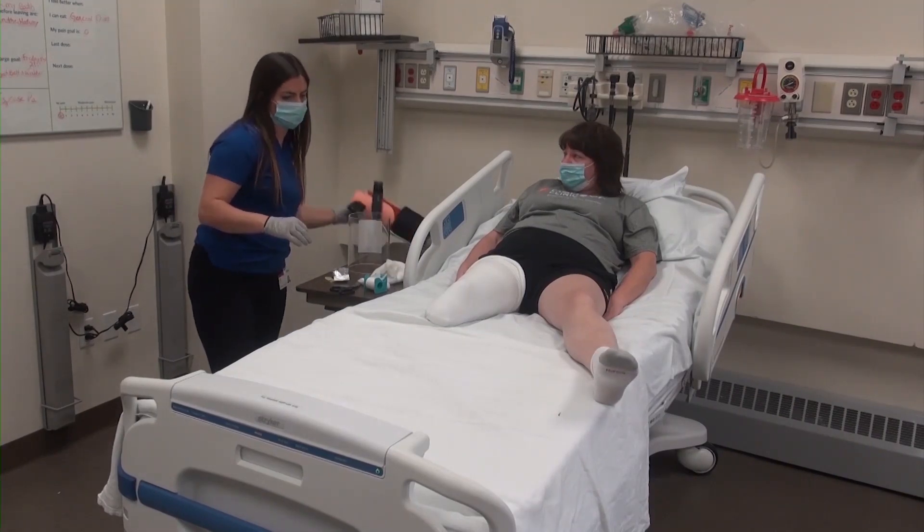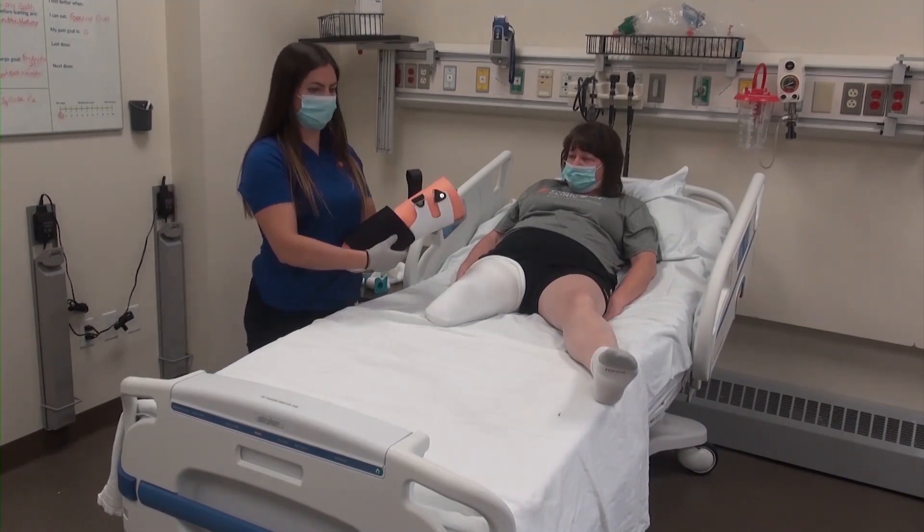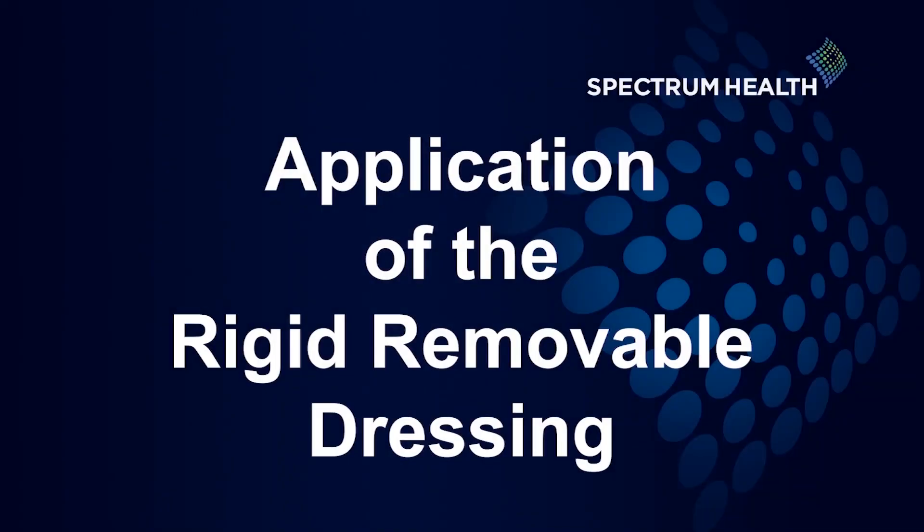This also gets the patient used to differing sock ply management, as this is needed for prosthetic wear. The socks can be layered over each other — just ensure there are no large wrinkles and that they are applied one at a time. Once the dressing has been changed, the shrinker is in place, and the sock is applied, the application of the rigid removable dressing is ready to be performed.